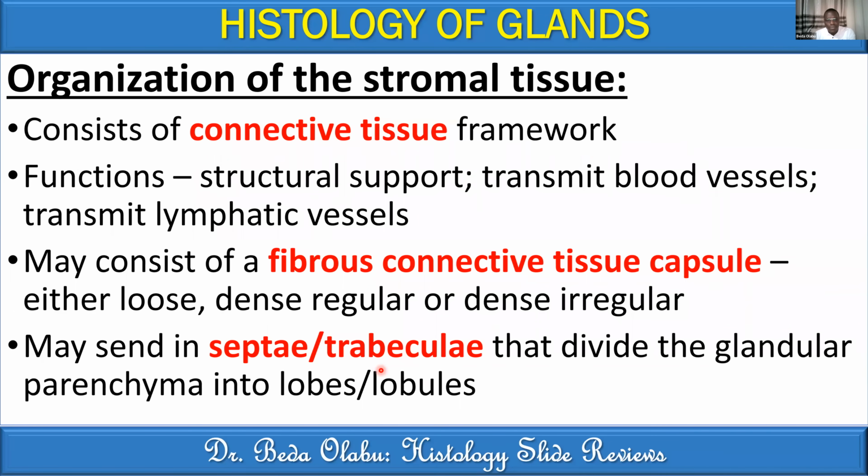Now, even though we have trabeculae going in, these trabeculae still function as supporting framework. They still transmit blood vessels and they still convey lymphatic channels. Now, based on this, again, there are some glands which have very definite trabeculae. You're going to see them, they're prominent.